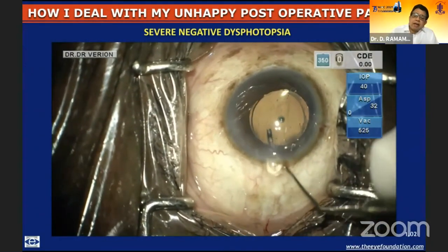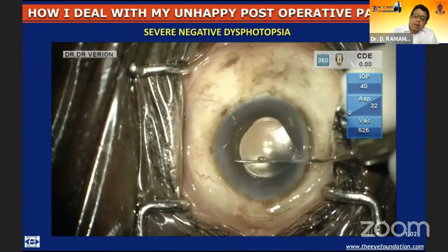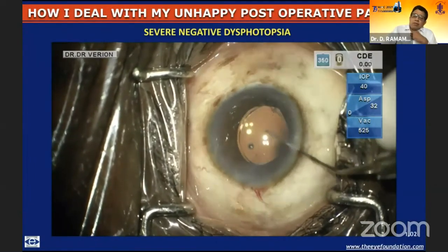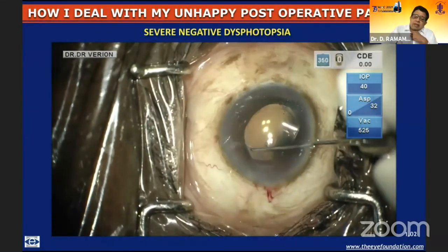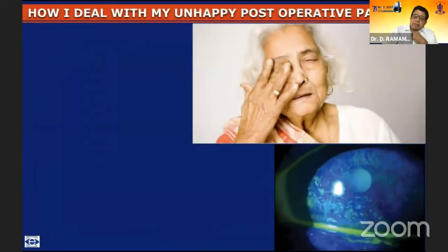So I went ahead and implanted a piggyback lens with zero power. Because it has a rounded edge and the square edge of the primary lens has been masked by this lens, almost immediately the dysphotopsia went away. You could, of course, do a YAG capsulotomy for the edge of the lens also, but I prefer to do this. There have been three other cases where I have done this with excellent results. So this is one way of dealing with negative dysphotopsia. In this situation, you can see the two lenses, the primary lens and the secondary lens, both on the slit lamp and on the anterior segment OCT.